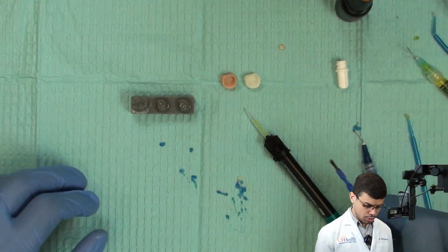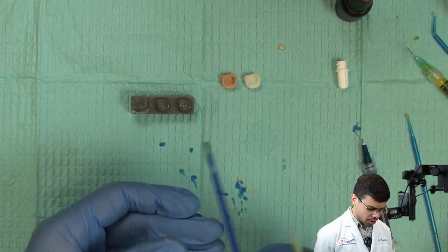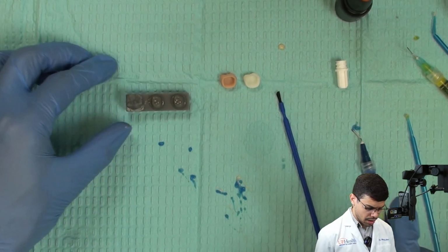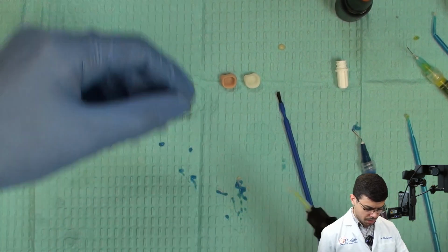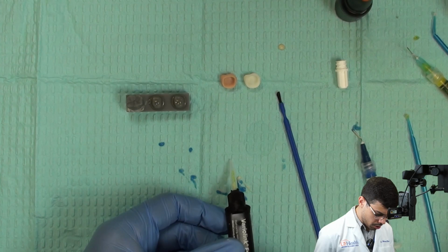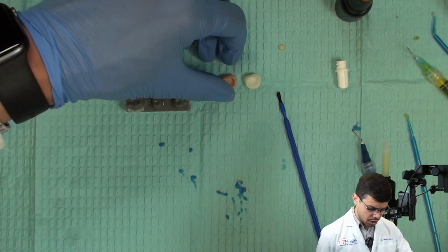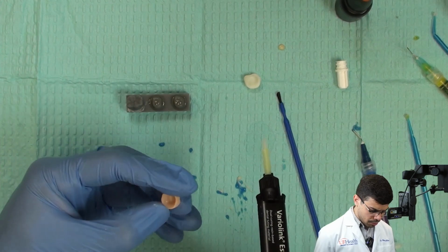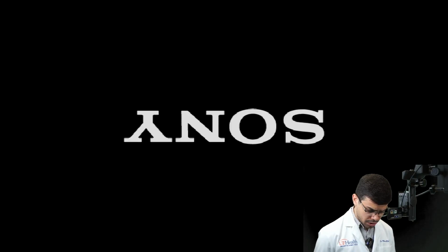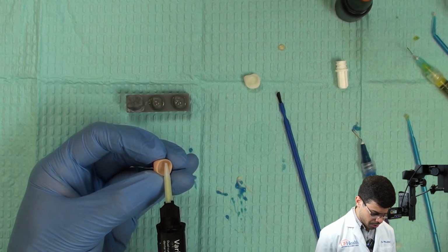So what we're gonna do is we're gonna get the Variolink DC cement and a Benda brush, and we're gonna cement these two crowns at the same time, okay? I'll start with the glass ceramic. So in this way, I'm going to go ahead and extrude a little bit of the material here. And the same principles that we use for the cementation of the resin modified glass ionomer, we're gonna use here, okay? So here we go.